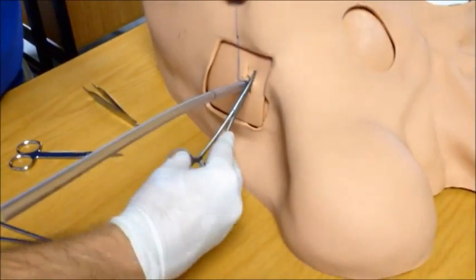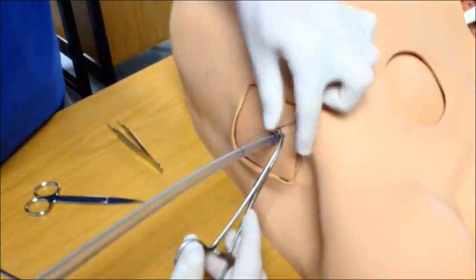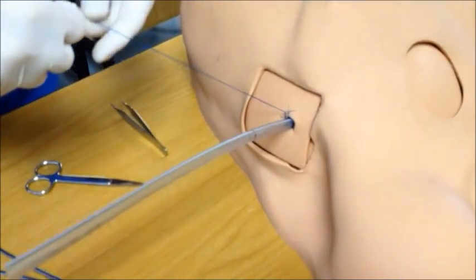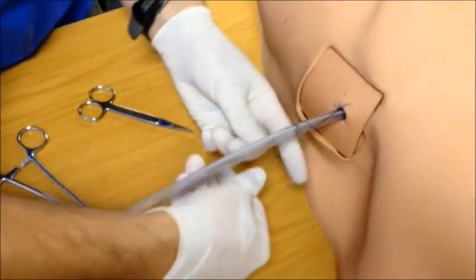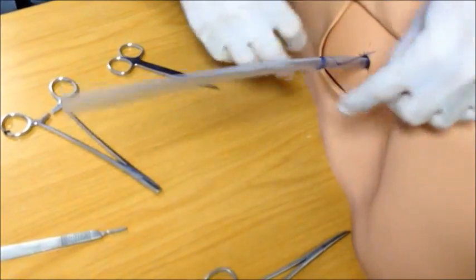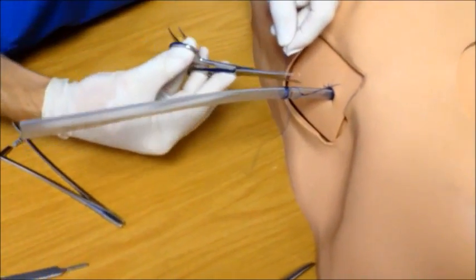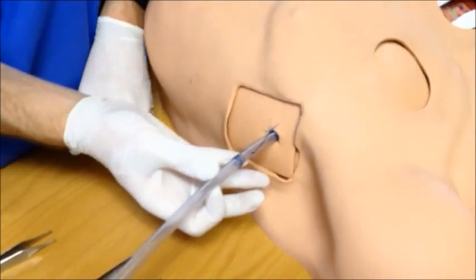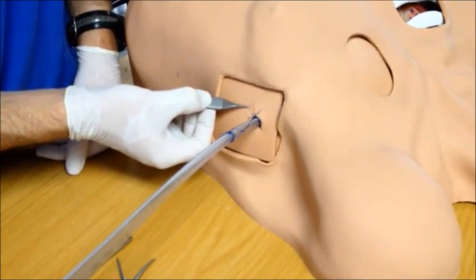Due to the nature of the vertical mattress suture, there is a skin loop on one side of the wound. Insert your curved artery forceps through there, grab your suture material, and pull it out. Reconfirm the tension on the tube is proper with your suture material and bring the knot up. Without excessive tension, tie a simple knot and secure your chest drain in place. Trim the edges of your suture material. If you have extended the wound for any reason, simply suture that piece of wound with a simple suture.